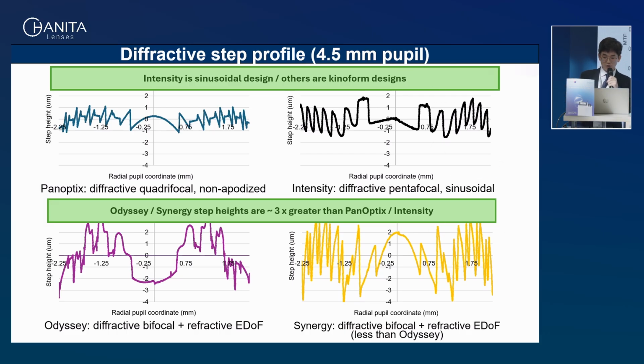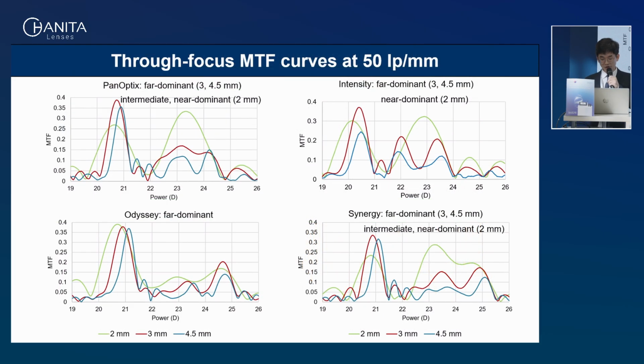And also with the through focus MTF curve, you can see that this 3mm pupil size result is exactly the same as what the company provides. So their design is, I want to say, reliable.